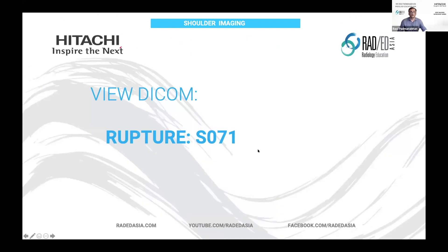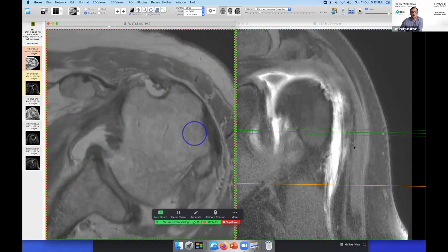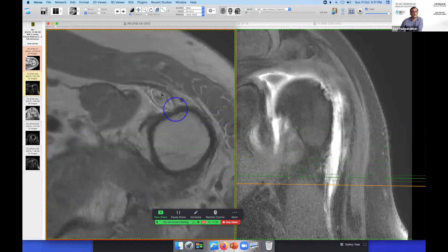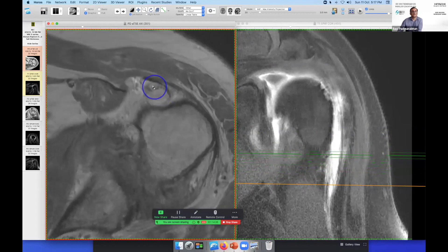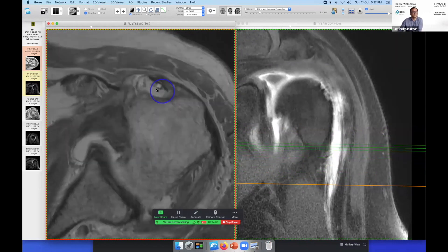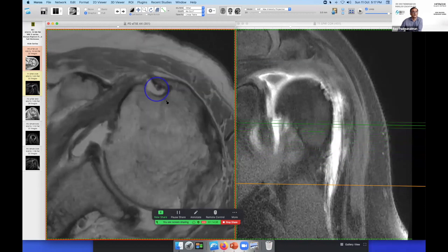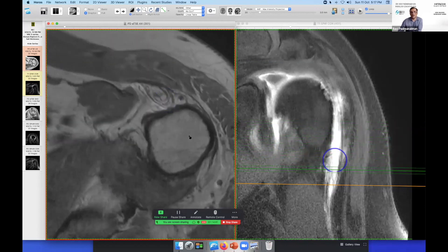Let's have a quick look at this case. You can see the cross-reference showing where we are. Here's the biceps tendon sheath — we really don't have anything in it. You can often see there are bits of debris, but that's not the tendon; this is just some debris within the tendon sheath. So we've got an empty tendon sheath where it's really unclear where it's been pulled back to. We'll just say that the distal stump cannot be seen.